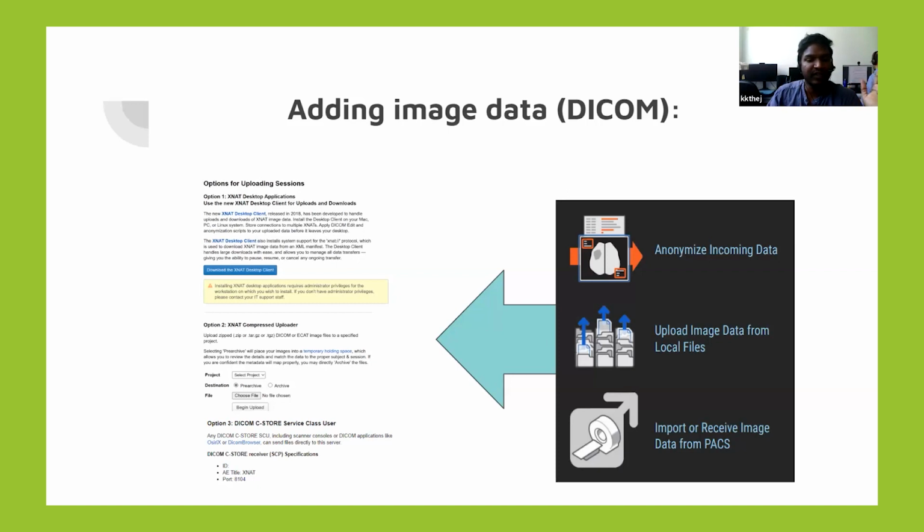So we have all the options here to change things if some data is misorganized, and you can just begin the upload, and it goes through the processing and uploads the data as you saved it on your local PC.